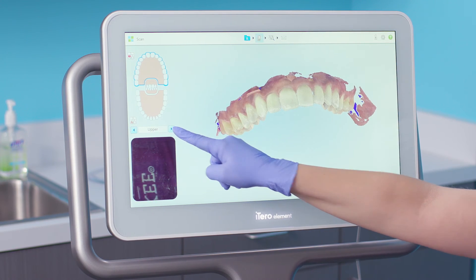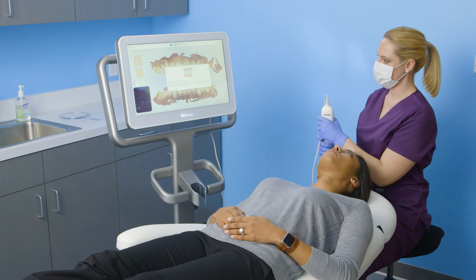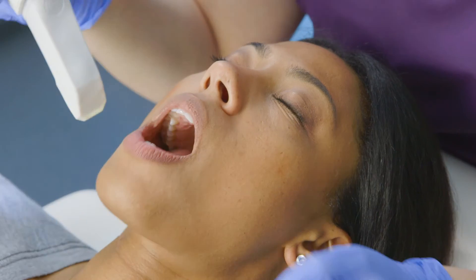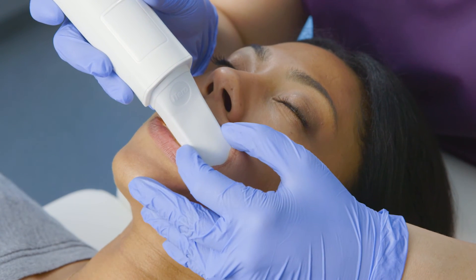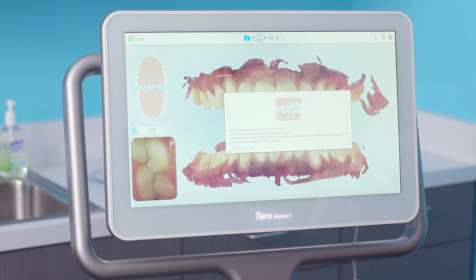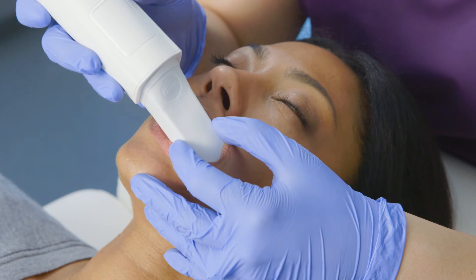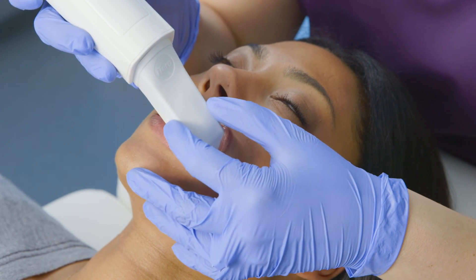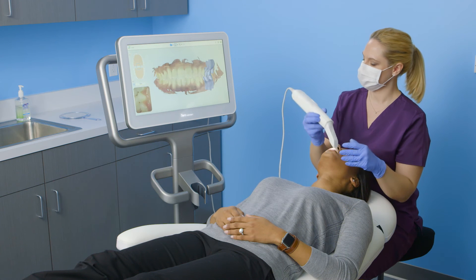The final segment is the bite. It's recommended to confirm the correct bite prior to scanning. When I'm ready to begin scanning, I'll have the patient open, use the wand to retract their cheek, and have them close in centric occlusion. I'll bring the wand tip gently against the teeth, observing the occlusion in the viewfinder. Moving forward in a small wave-like motion, I'll capture three to four teeth, and then move to the contralateral side using the same technique.